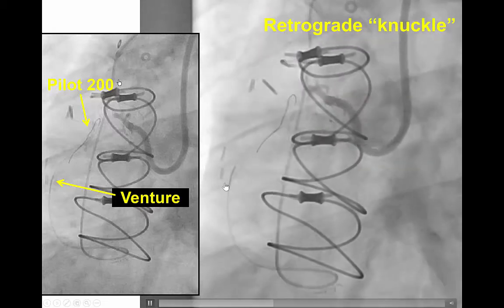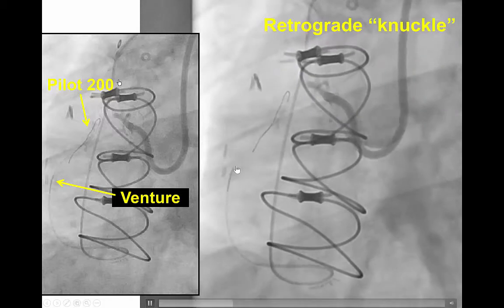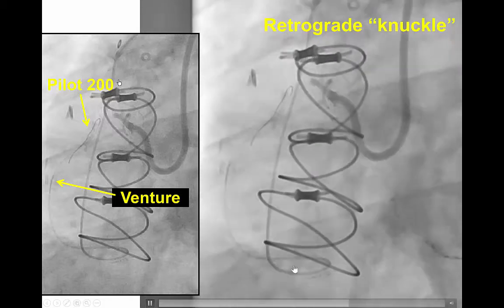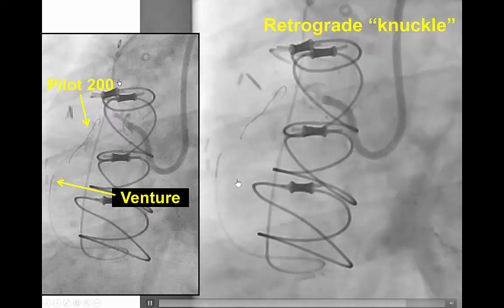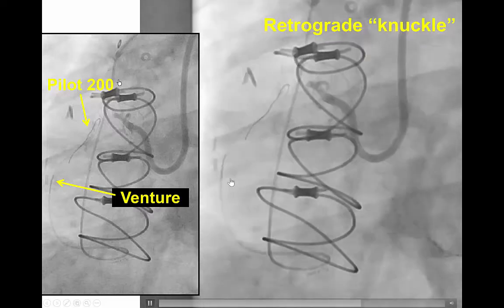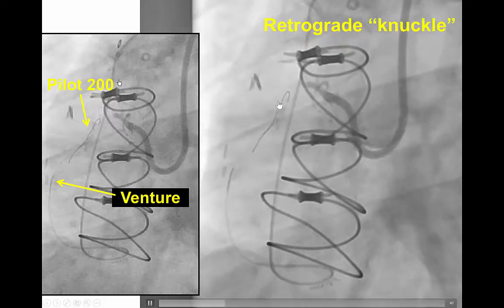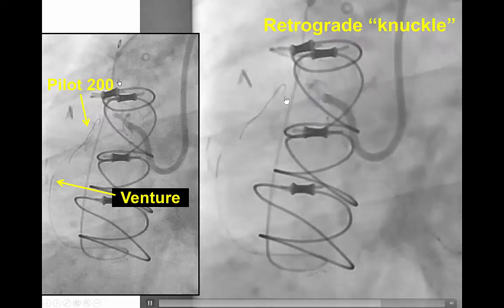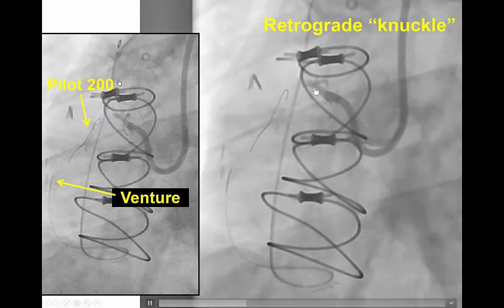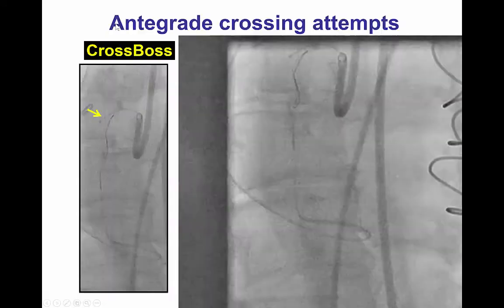Using the Venture microcatheter, which can take a bend at the distal tip, we were able to advance the wire retrograde into the distal RCA and the mid-RCA, and then advance a knuckle wire from the mid-RCA all the way to the proximal RCA. By doing this, we now have a better understanding of the course of the vessel in the proximal right coronary artery, and this was used as a target for antegrade crossing attempts.